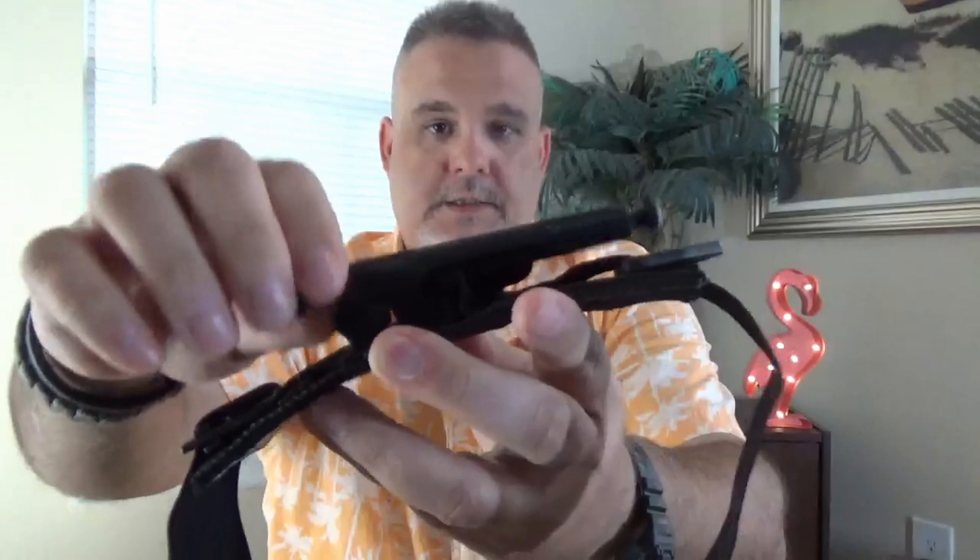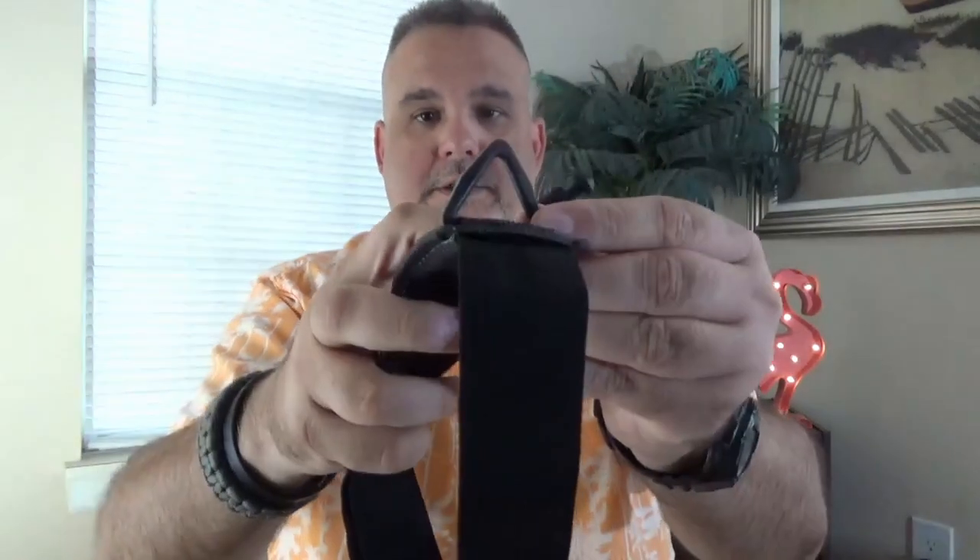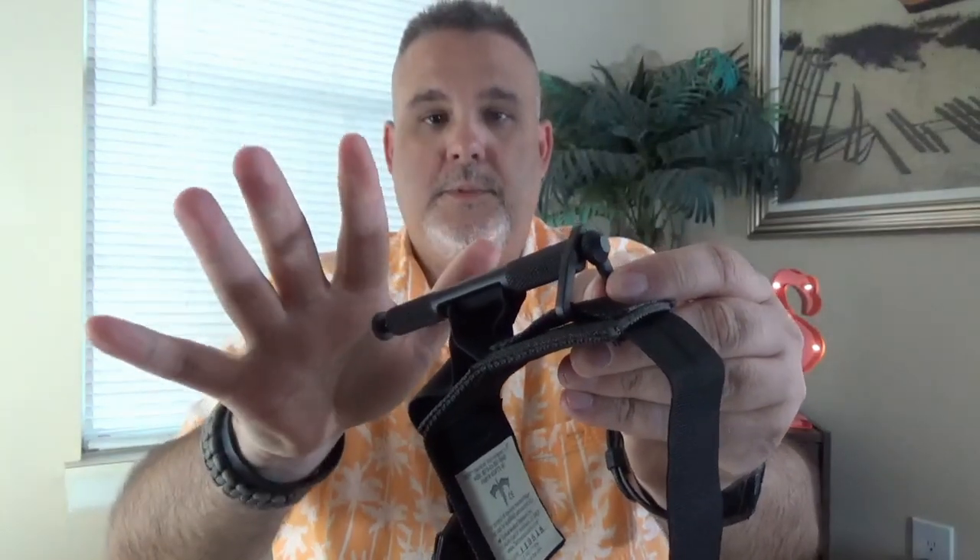The next thing we'll talk about is the windlass. It's aluminum and has a knurled texture to it. That way, if the tourniquet gets covered in blood or your hands get covered in blood — which tends to get kind of slippery — you can still get a grip on the windlass, turn it, and make this thing do what it's supposed to do. Once you get it tightened, it locks into this little plastic triangle, and it holds the pressure and tension that you've twisted.